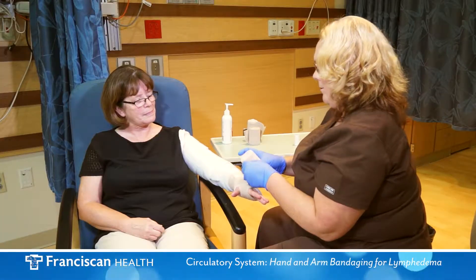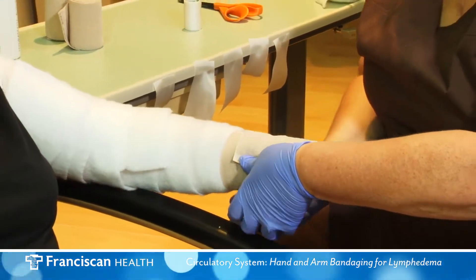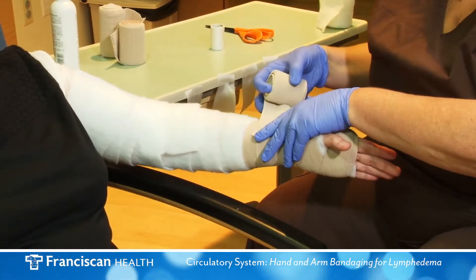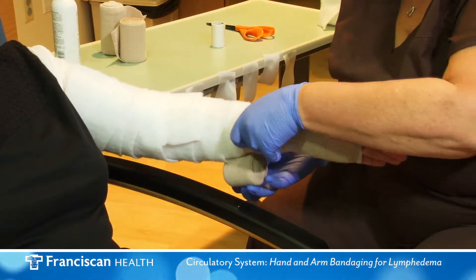Second bandage: use the next largest bandage in your kit. Begin at the wrist. Each individual turn overlaps the previous turn by approximately 50% in a spiral fashion, covering the entire forearm.